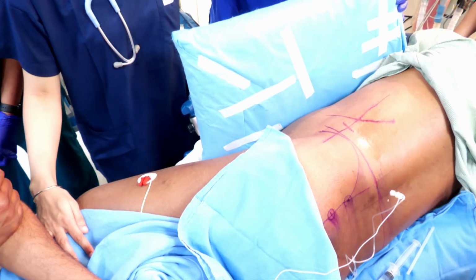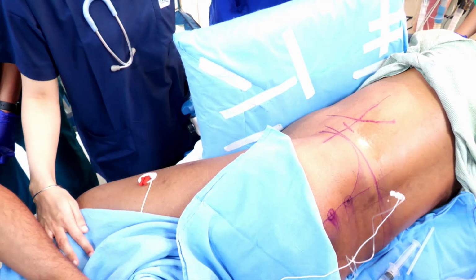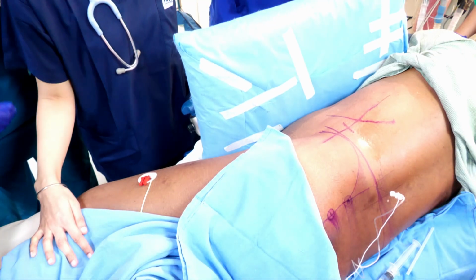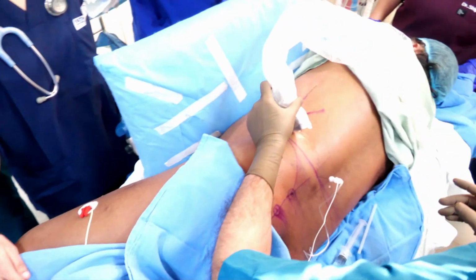So I'm just going to apply the probe and let's see where our needle is. Contractions at 0.2 milliamperes. Yes, so we are in. So we'll withdraw the needle. Yeah, we withdraw, but I will place the probe first and assess where exactly our needle would be.